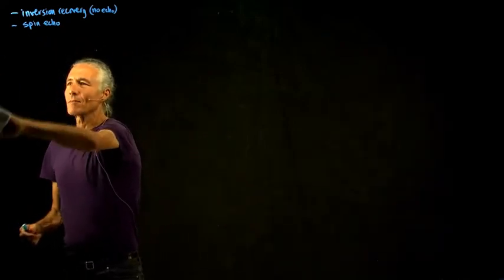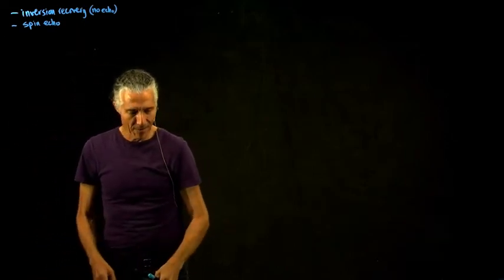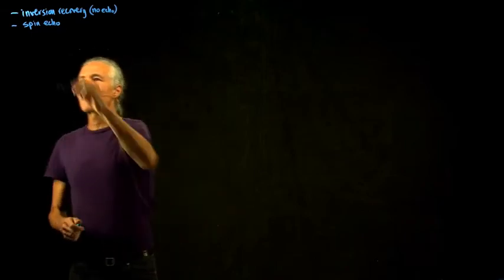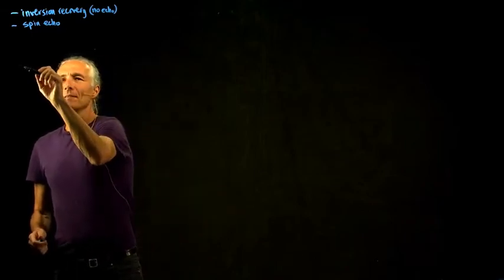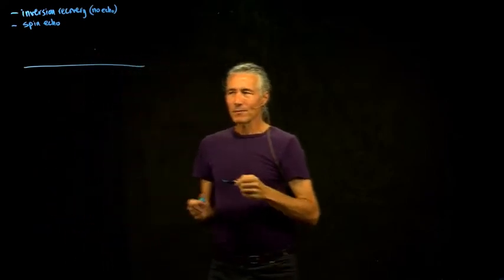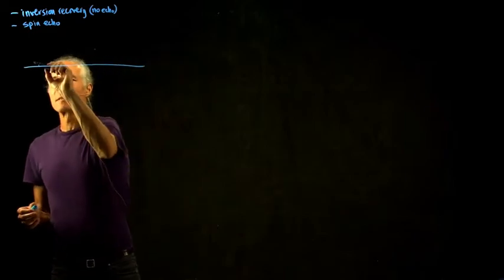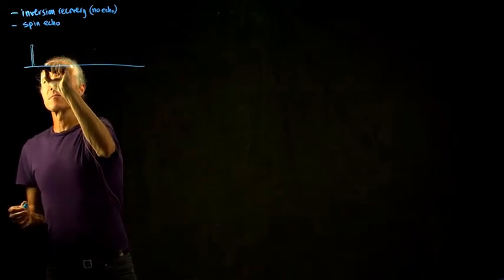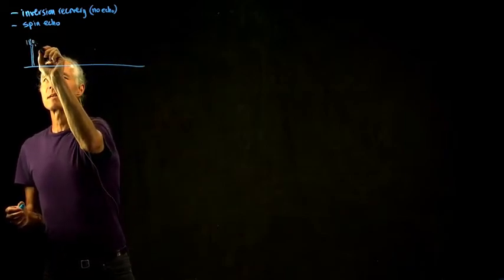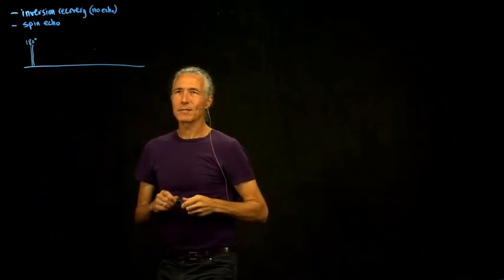So inversion recovery is one way of emphasizing the contrast difference. Inversion recovery is a very, very straightforward pulse sequence, and we'll just look at simple inversion recovery with no echo. So what is inversion recovery? If you do a 180, that's an inversion. So what does that mean?